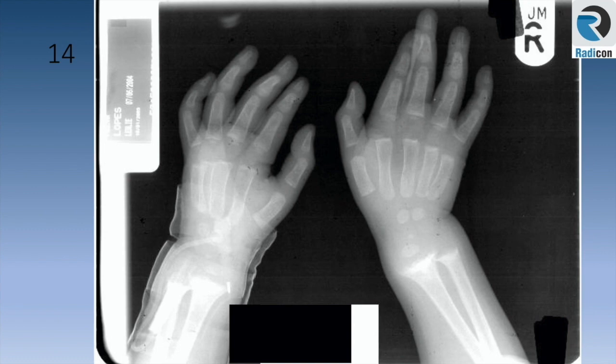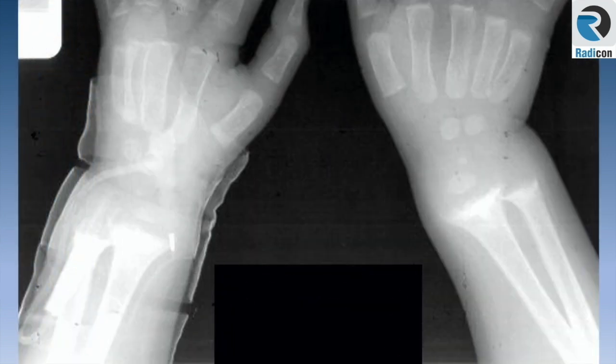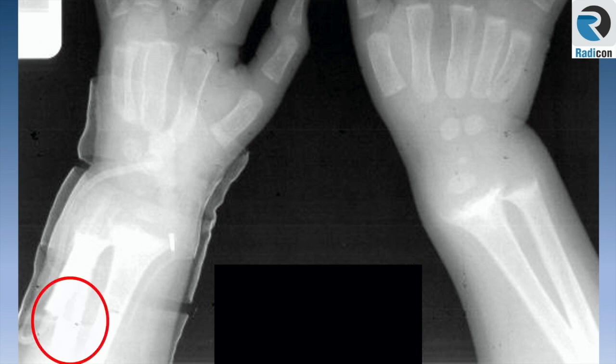Case 14 shows bilateral wrists of a child. Look for the metaphyseal abnormality of radius and ulna bilaterally. Fraying of the metaphysis is obvious — this is rickets. But before you move on, look at the edge of the film: there is a fracture of the distal ulna present as well, which must be picked up to get full marks.